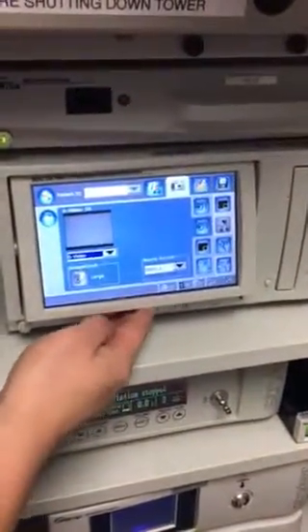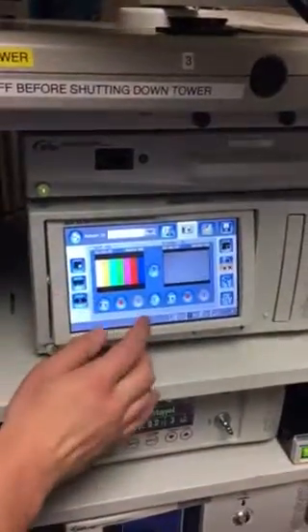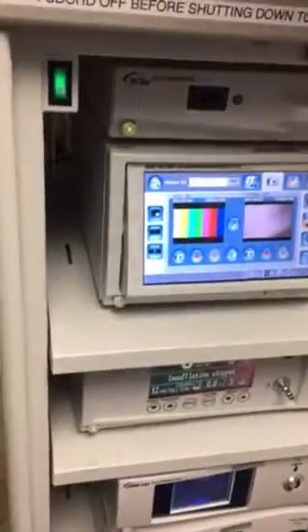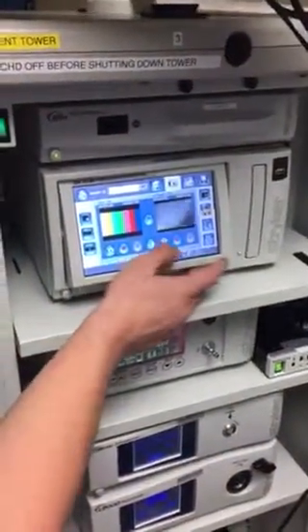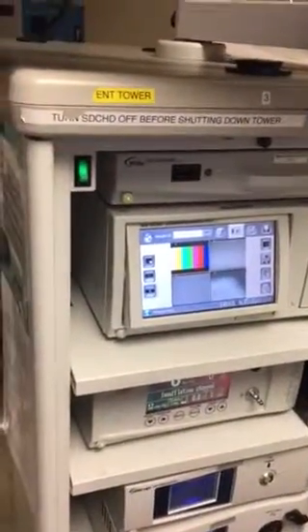There you go — so then your screen will show the video screen and the microscope screen. Take a picture and we'll see if it worked. Go ahead, take a picture. It works — you can do a print too. So that confirms it's working.